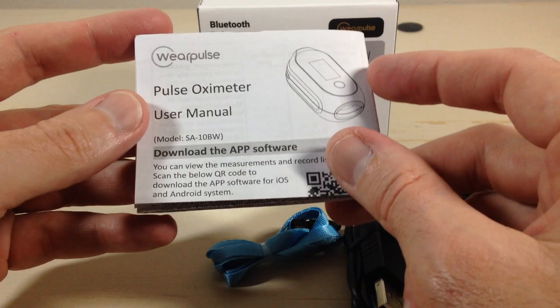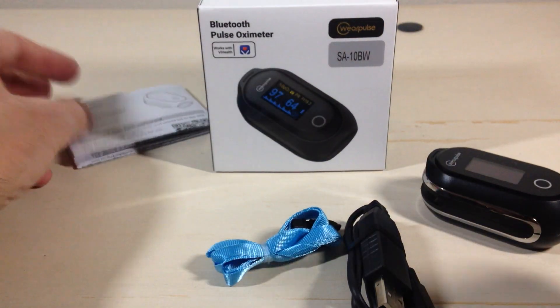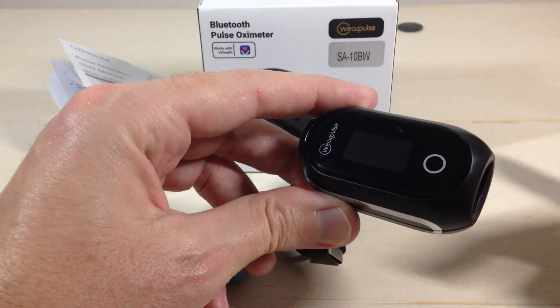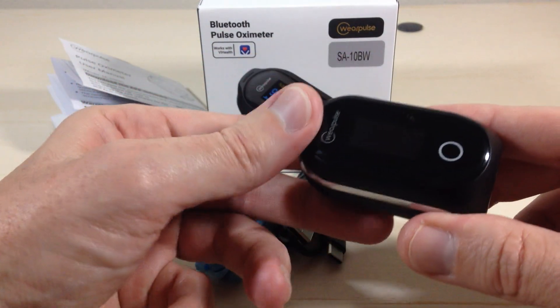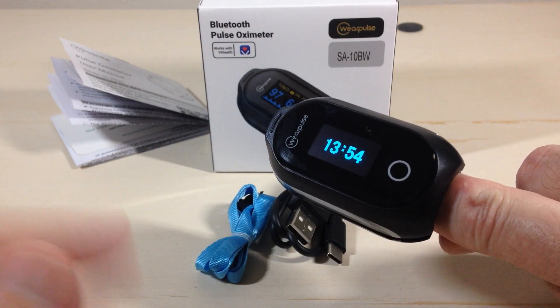Aside from that, you basically get your instruction manual, which gives you information about the ViHealth app if you want to use it. It has automatic on and automatic off — so when you want to take a reading, all you're going to do is open it, simply put your finger in, and wait a couple seconds. It'll start reading.